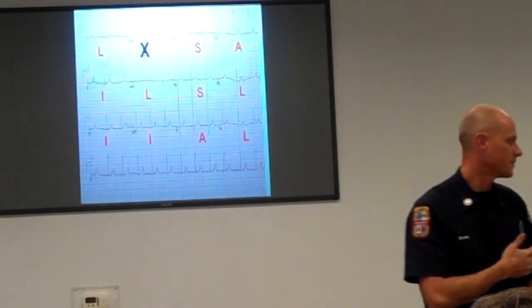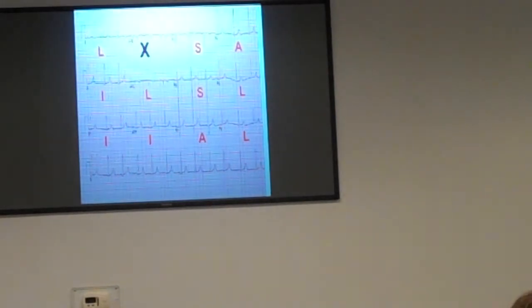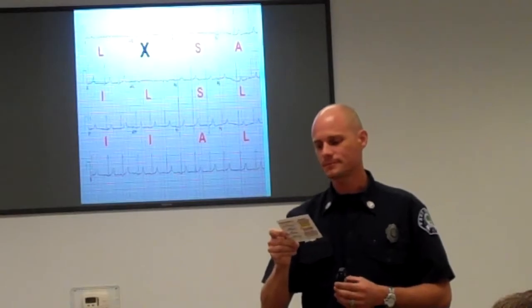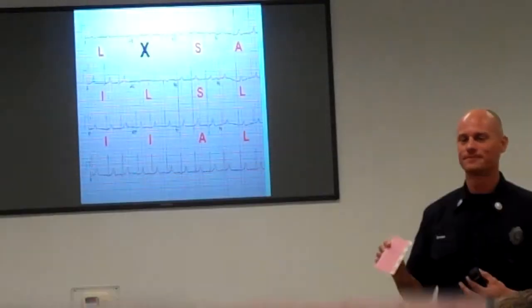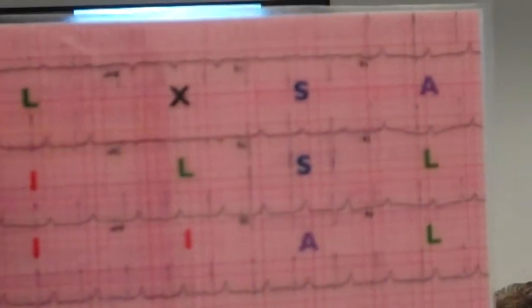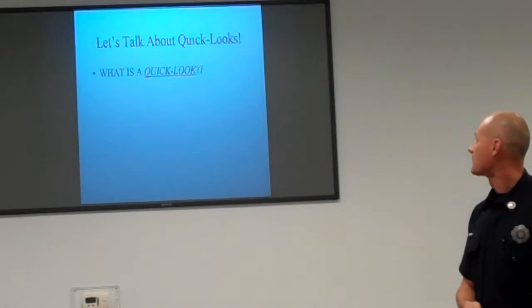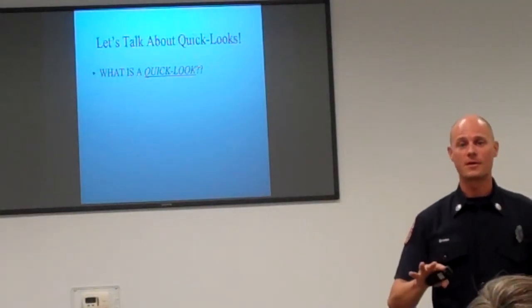And I think if you flip your card over, I think it says that again. No, it doesn't. Okay, either way, you guys get the picture. So that's a good way to remember what part of the heart you're looking at if you don't have your little cheat sheet. Real quickly, I just wanted to talk about quick looks.